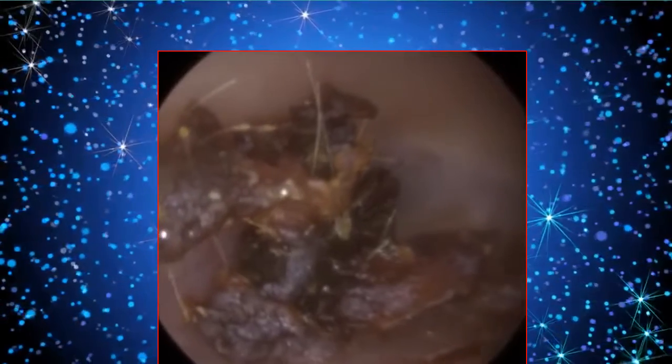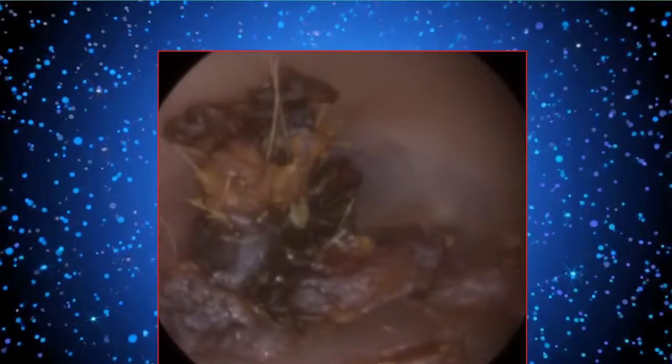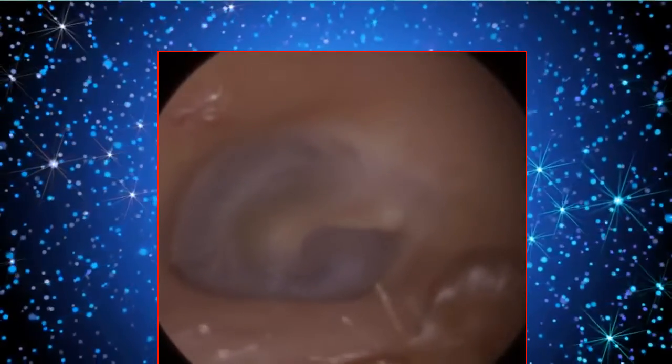This type of wax has a rough surface, so when the patient talks or chews, it can rub against the canal wall. When you open your jaw, your ear canal widens up to the second bend, so about up to a centimetre into the ear canal, the cartilaginous portion. And when you clasp your jaw, you somewhat contract your ear canal, you narrow it. So when the patient talks or chews, when the ear canal goes up and down, it can be rubbing against the surface of this dry wax, which can be a bit uncomfortable for the patient.